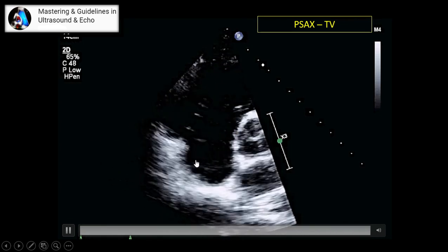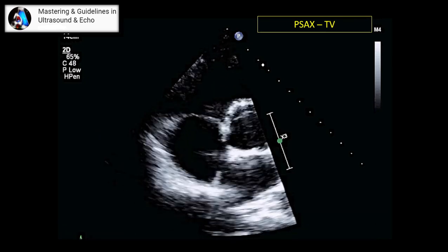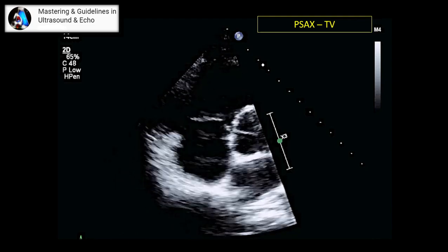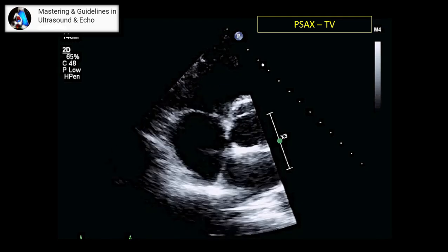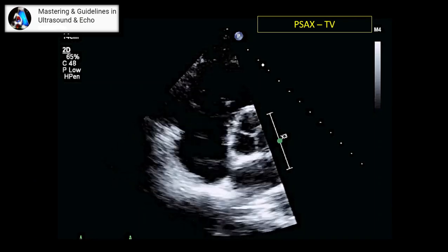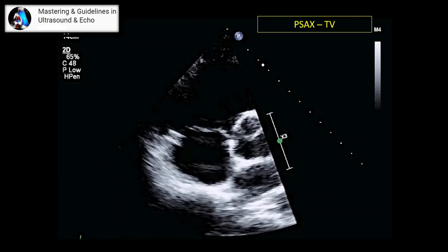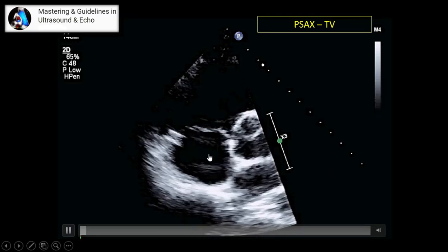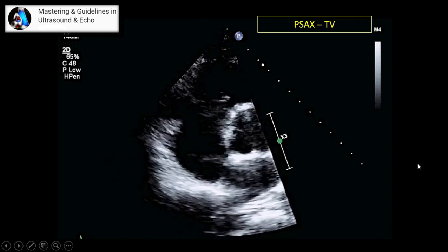If it doesn't show up, slide a millimeter or a little down and angle up, or the opposite way, slight up and angle down, or search circularly around that area with fanning and angling to the right hip. The tricuspid valve and right atrium show up very clearly.